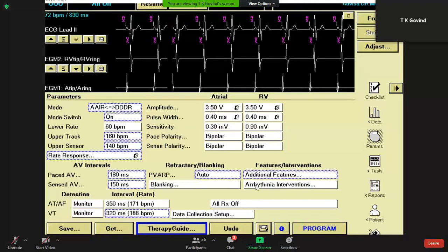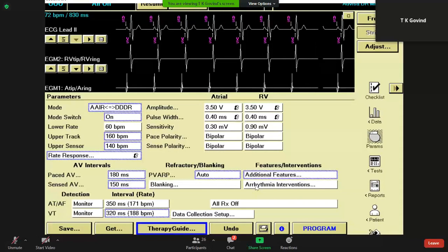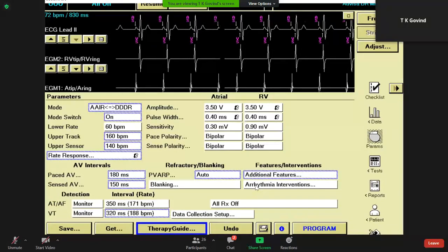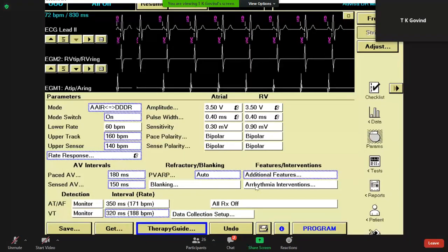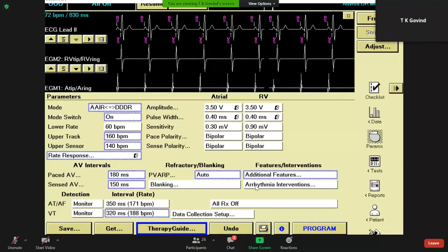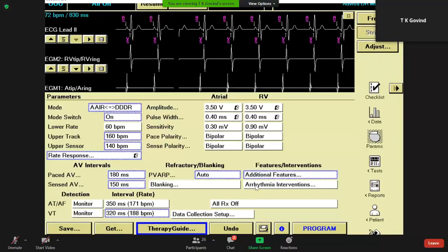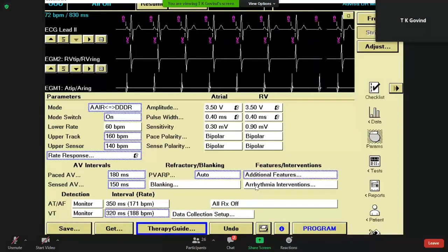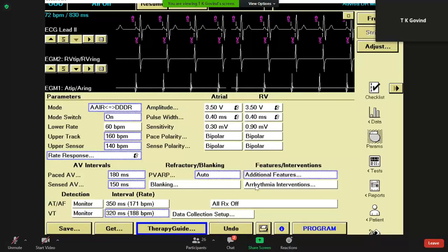So in this case, we want to check the threshold and increase the atrial output. A similar thing can happen if there is atrial oversensing or undersensing. If there is atrial oversensing, then it starts an AV interval and paces, but there is no P wave. So that V-pace after an atrial oversensing tracking is equal to a PVC that can initiate a retrograde activation. So recognize that, look for that. If you find evidence of that, correct that, then PMT will not happen.